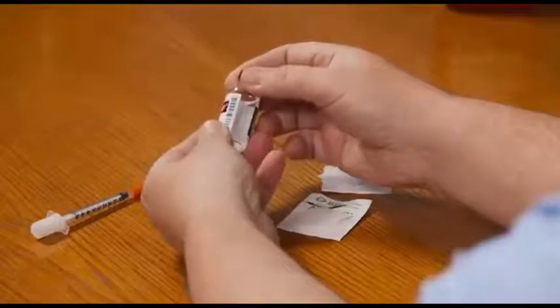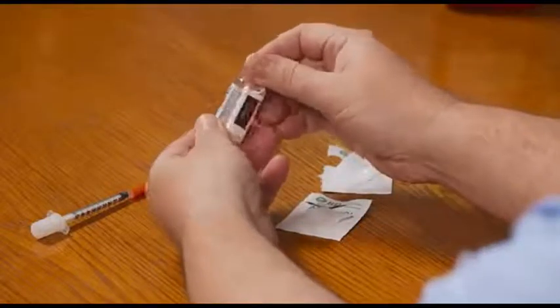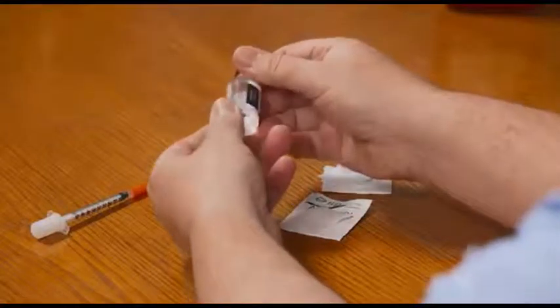Before injecting, always check the insulin closely. If it has any lumps or crystals or a strange color, dispose of the insulin and use a new bottle. If you have any questions about the way it looks, check with your pharmacist. Now, if you're using clear insulin and it looks okay, then you're ready to inject.